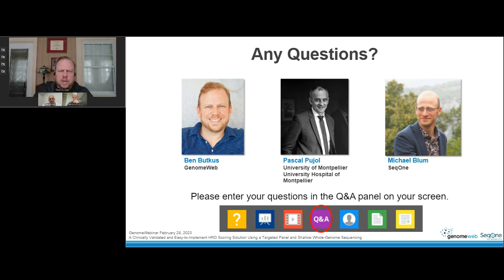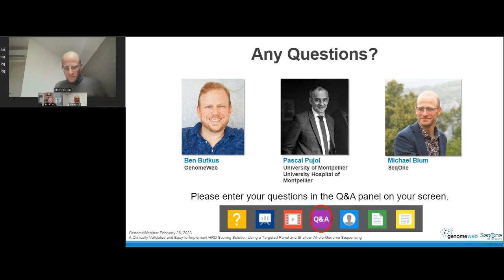How is it possible to have such a low rate of NC results? I'm not sure what NC. Non-conclusive, Ben. It's a rate of non-conclusive. The reason for that is that we have trained the model on samples which have been computationally diluted, so that the model knows how to handle samples with low cellularity, low percentage of tumoral compound.